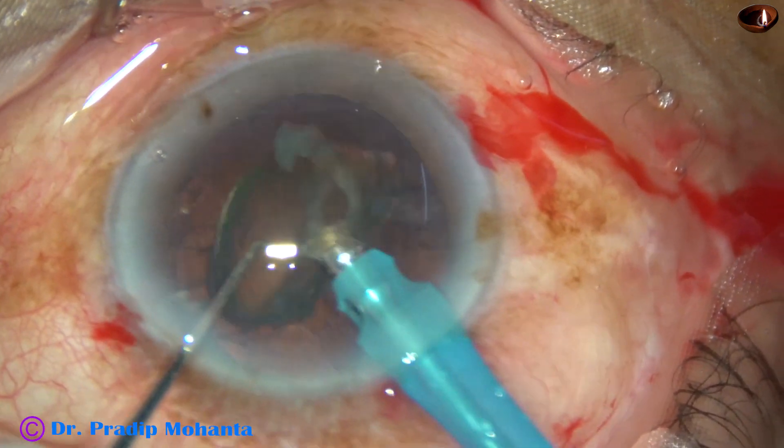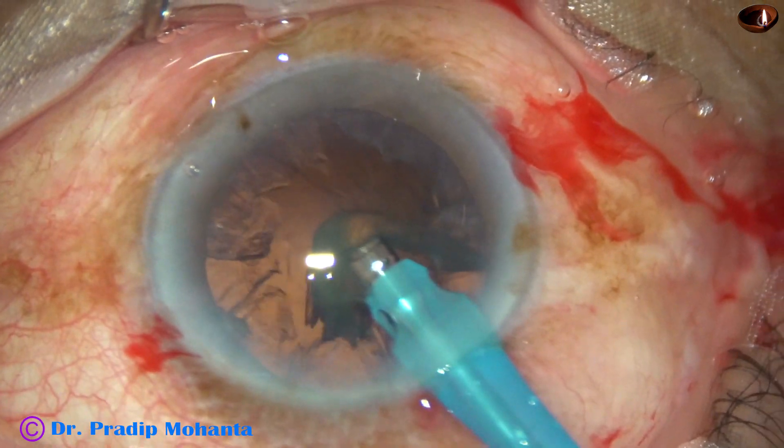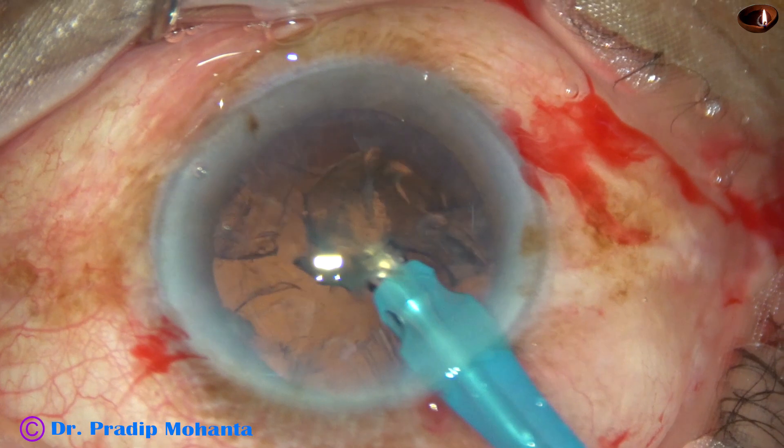And here it is — the nucleus and epinucleus is removed.